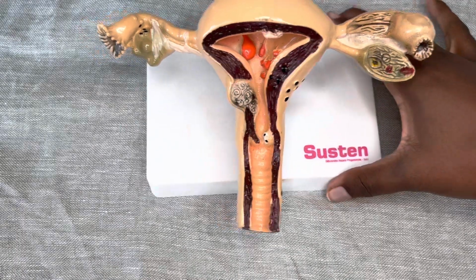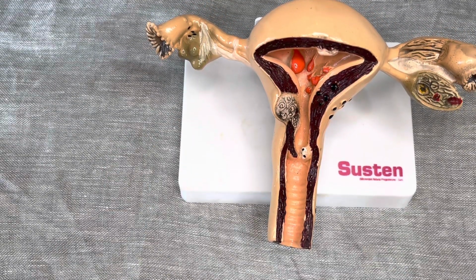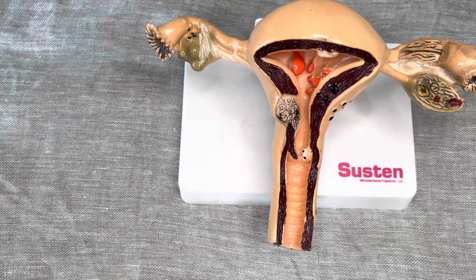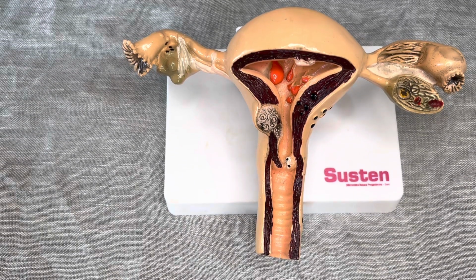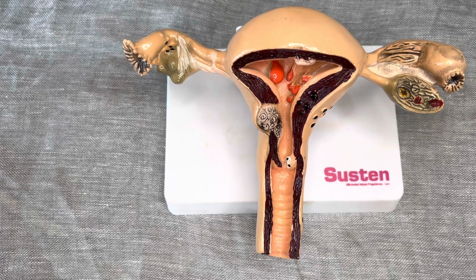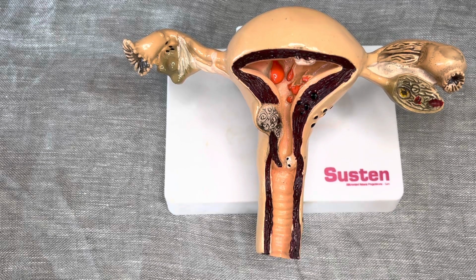So as you can see here, this is a uterus, or rather it's a demonstration of how the uterus should look like. So don't concentrate too much on everything that is happening, because that is a story for another day. Today I just wanted to talk about the coil, the copper T wire, which is a method of contraceptive, because people have been having concerns. They have a problem with inawekwaje, what happens, is it painful? And so I wanted to take you through and explain exactly how it's done, so that maybe you have less fear next time you're going for the procedure.